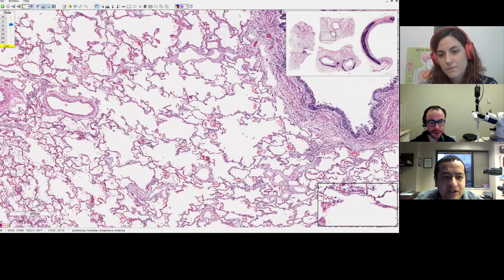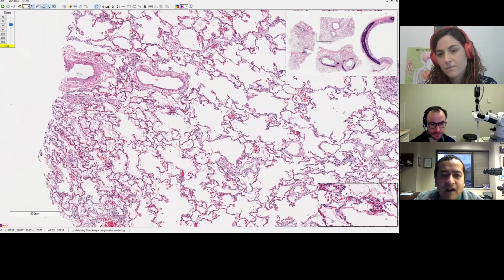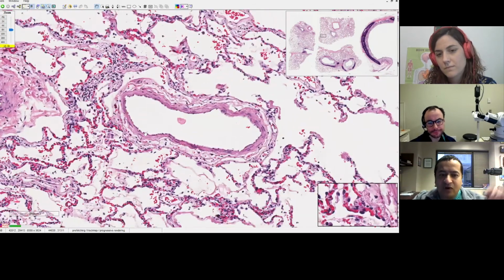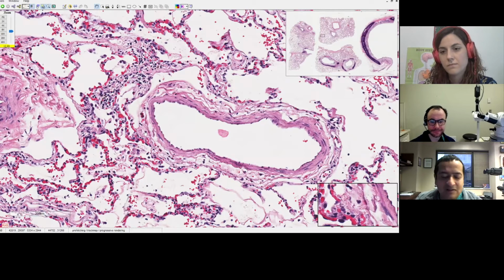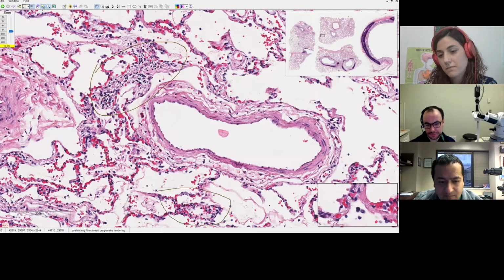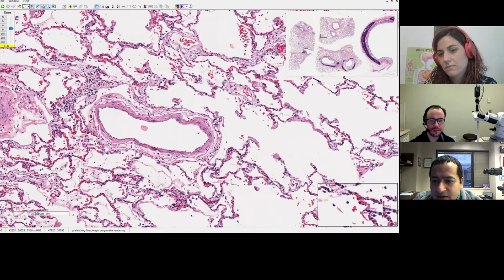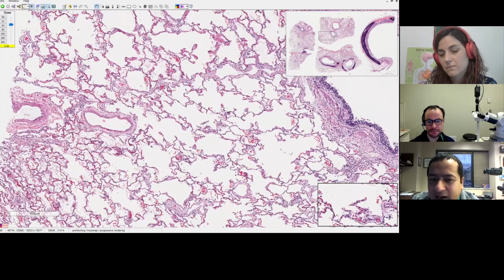Let's see what else we can see here. So should we talk a little bit about the interstitial infiltrate? Because that's also kind of an interesting thing. In viral pneumonias, classically for decades we have known that there is some kind of an interstitial pneumonia, like an interstitial inflammation. Actually, interstitial pneumonia is an odd term because even DAD is an interstitial pneumonia in a way. But what I'm saying here is that you can also get interstitial inflammation like this and interstitial lymphocytosis. And even that, to my eye, guys, it's not all that diffuse. It's relatively patchy. Let's go back down. So it's not the kind of interstitial inflammation you get in NSIP or hypersensitivity. It's very patchy interstitial inflammation.